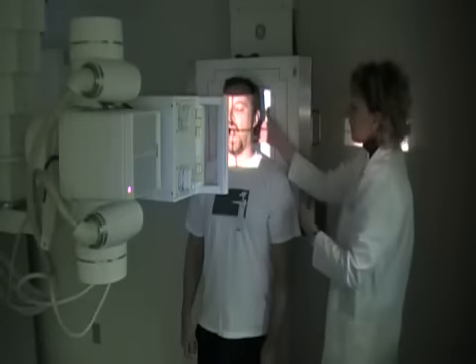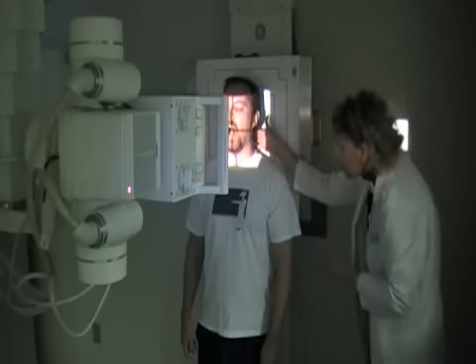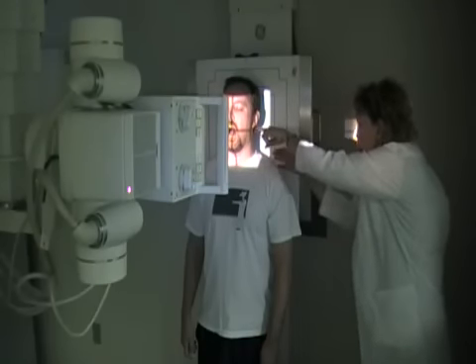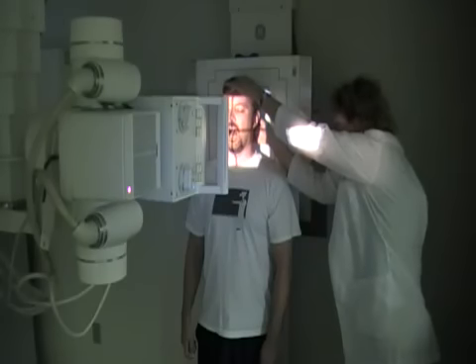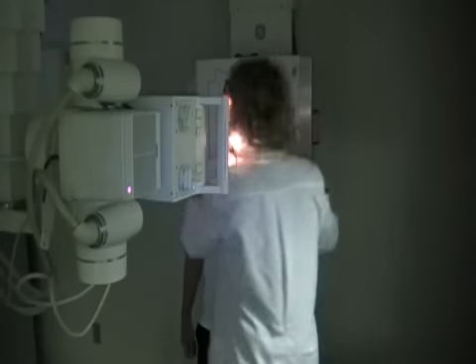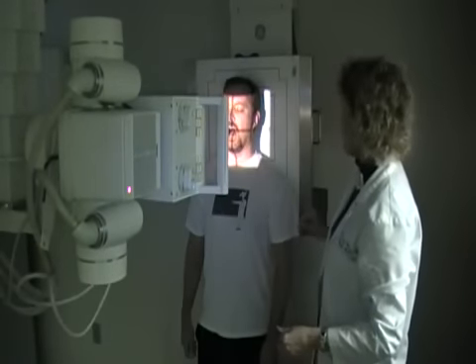If you have that as a nice horizontal line, then you're ready to ask the patient to open their mouth. Open your mouth wide, and it's really important they do open their mouth wide for this one. When they open their mouth, double check again, make sure the top of the teeth is a nice horizontal line with the back of the skull here, or the mastoid tip. Now I'm going to make a small adjustment to David's head so that that line is good and horizontal. You want to double check, make sure the head is straight, because you still want the mid-sagittal line on the middle of the skull there.